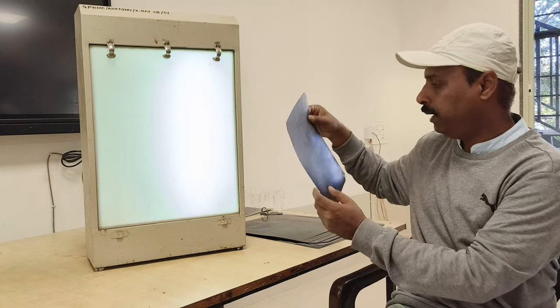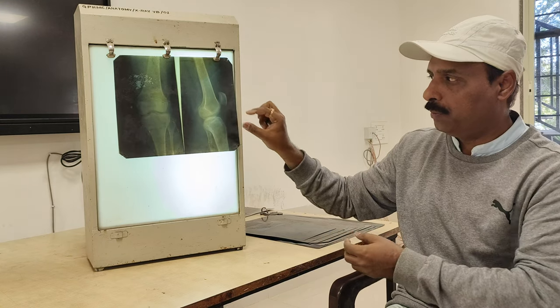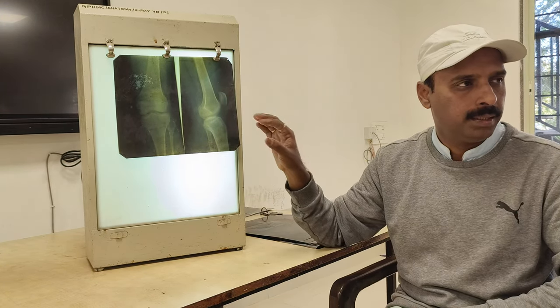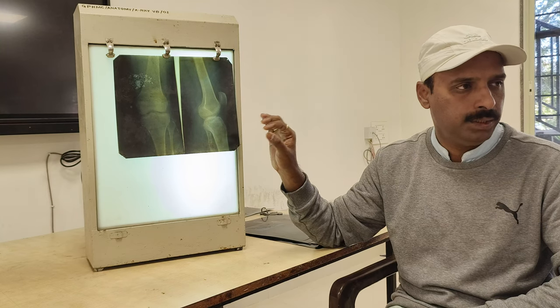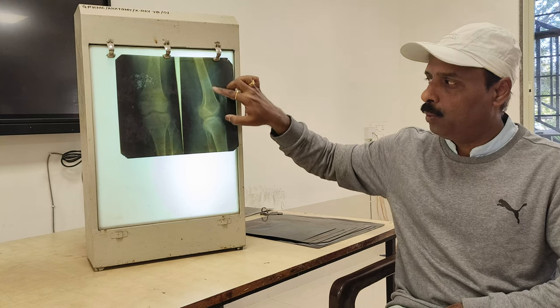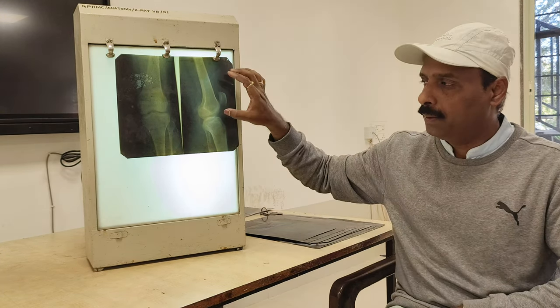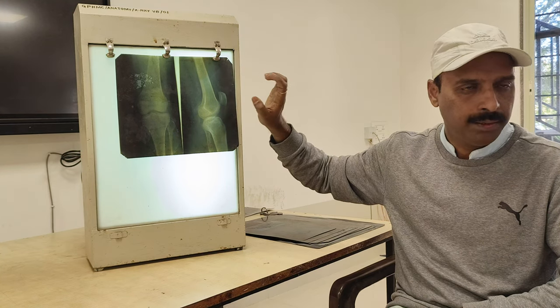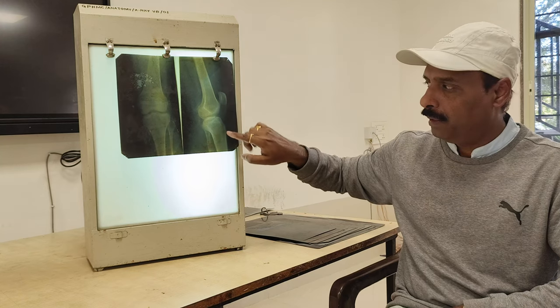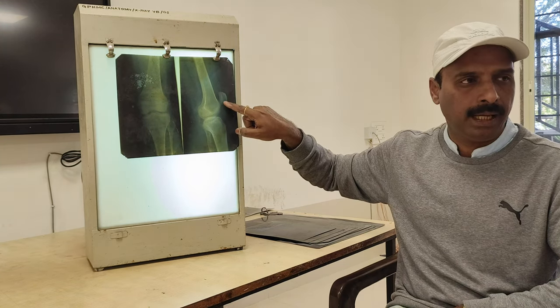Next comes the knee joint. This is an X-ray of the knee joint. This is a plain X-ray, and how to comment: this is a plain X-ray of the knee joint, which shows the lower end of the femur, the upper end of the tibia and fibula, and we have the patella.